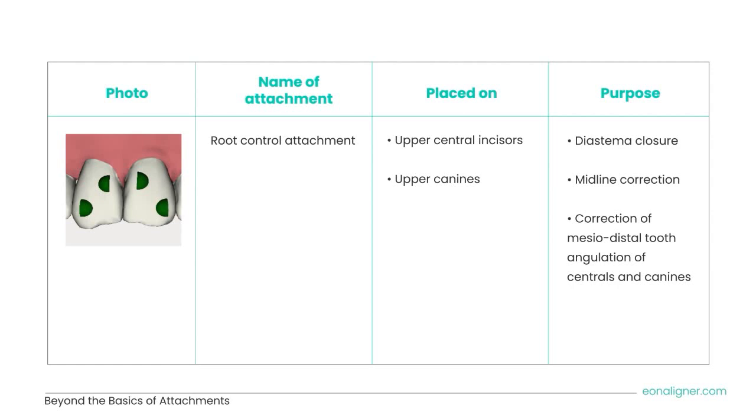Note that their function is somewhat similar to vertical attachments if placed on anterior teeth, as these two provide two active surfaces for application of forces. However, root control attachments were found to be more aesthetic. That's why they substitute the vertical ones on anterior teeth.